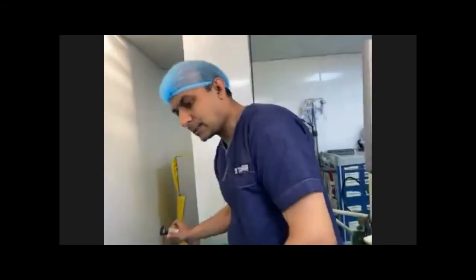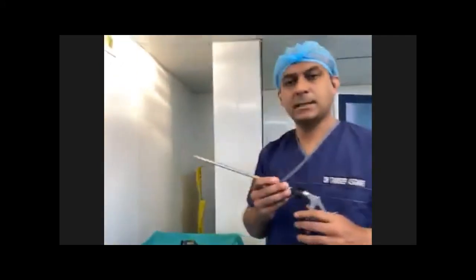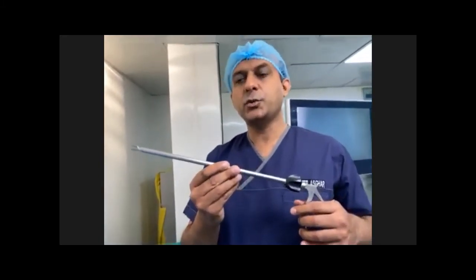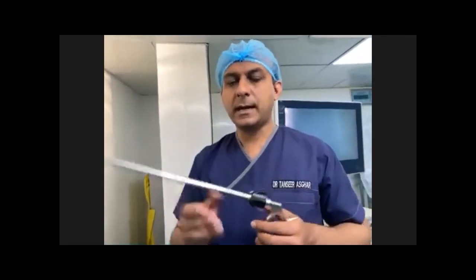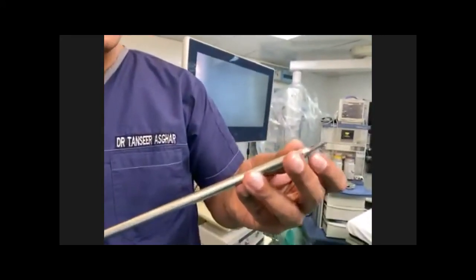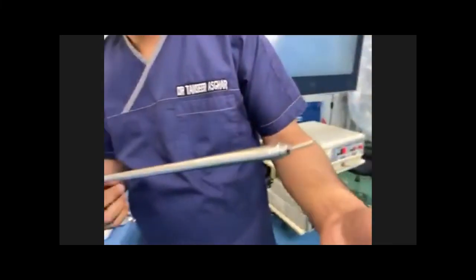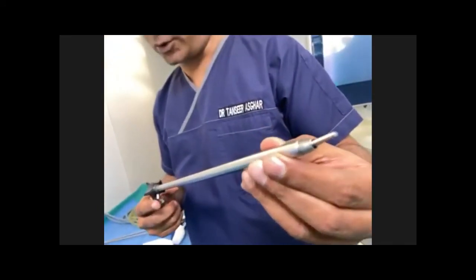So here you can see a clip applicator, which we usually use while clipping the Lega clips at the cystic duct or cystic artery. You can see it has got a place where you can put the Lega clips in. Then you just push it and the Lega clip is closed.